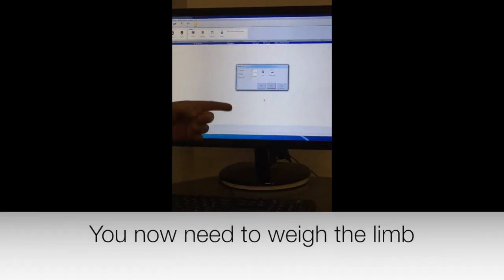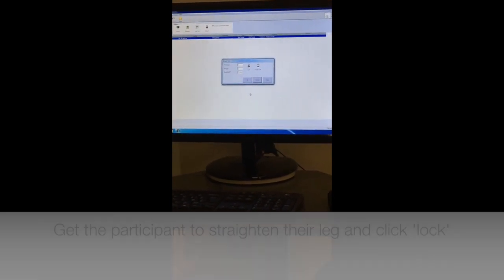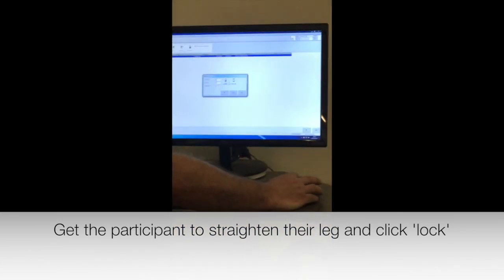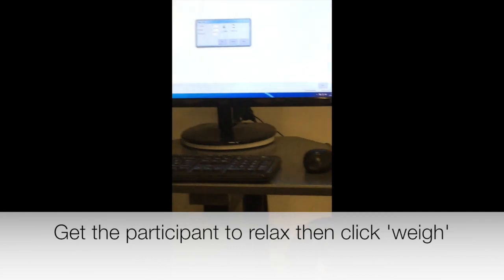This is where you're going to weigh the limb. And this allows it, you don't have to do this stage, I would, for each thing, because it then works out a load of calculations on the actual reports at the end based on the weight of the limb, and it adjusts for the weight of the limb. So basically what you do is just lift your leg up, there, that's fine, click lock, you can just go heavy, click weigh limb, massive, and then the moment you click unlock, it will literally start moving again.